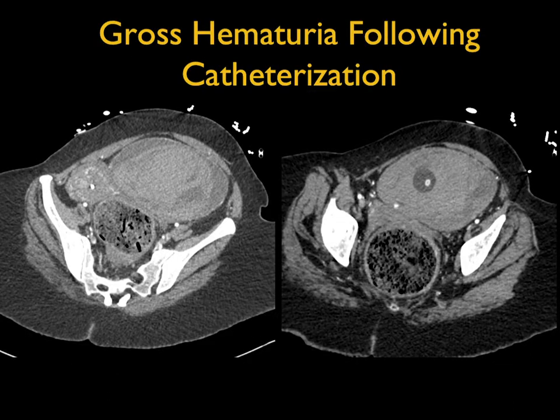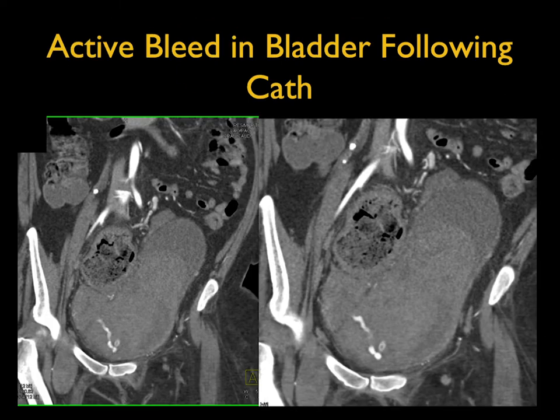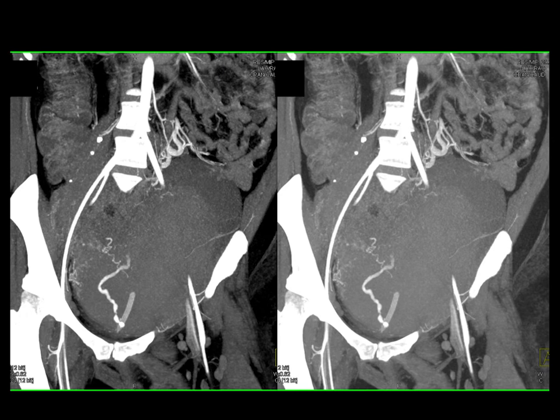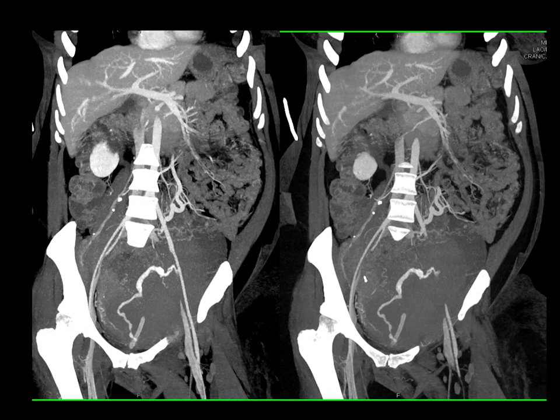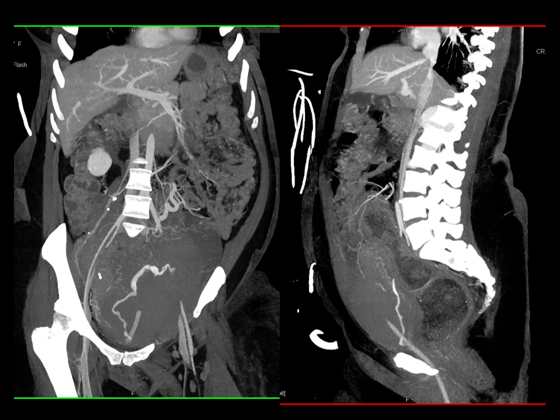In this example, a patient had traumatic insertion of a Foley with a lot of blood in the bladder. When you give IV contrast and look at the distended bladder with blood, you clearly see the active extravasation. If you're looking for hematuria, we want to scan through the pelvis, particularly in older patients. Under 35 it may not be as critical because bladder cancer short of trauma is unusual. Active contrast extravasation is nicely shown on MIP imaging across a range of views.